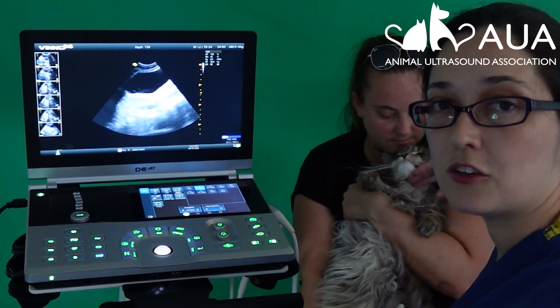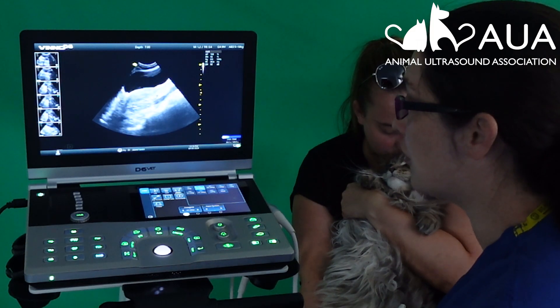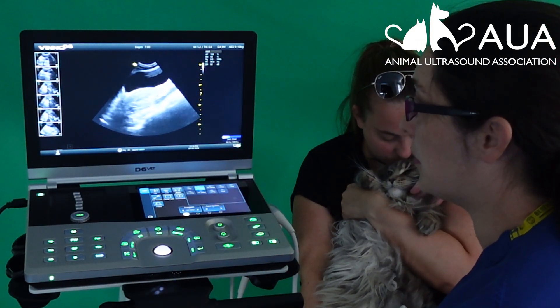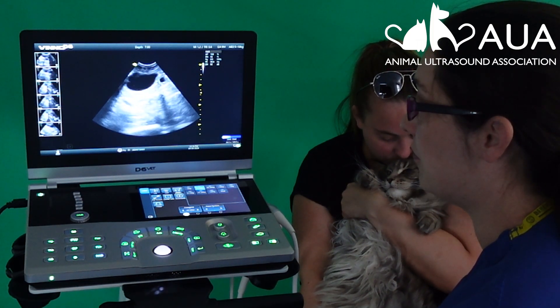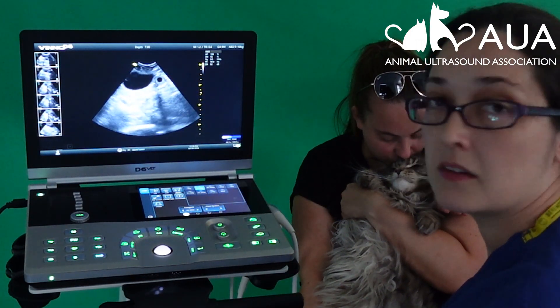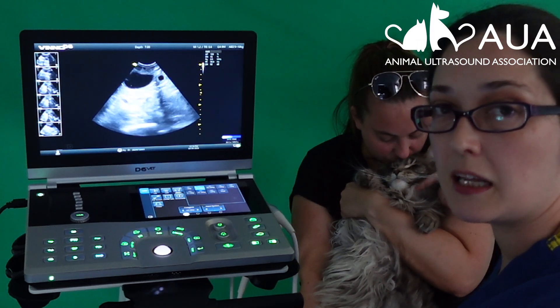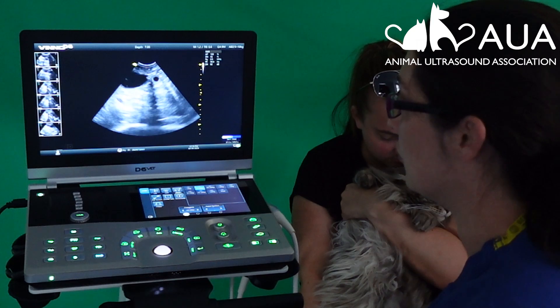To check for early pregnancy in a dog or a cat, you're going to be looking right by the bladder, and the uterus is just going to be underneath here. Just by tilting my probe very slightly, I can bring that very early sign of pregnancy into view. I wouldn't confirm pregnancy at this early stage because I can't see an embryo, but I can see that the mating has been successful so far.